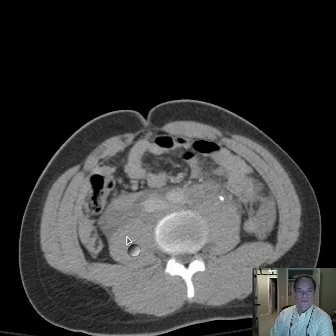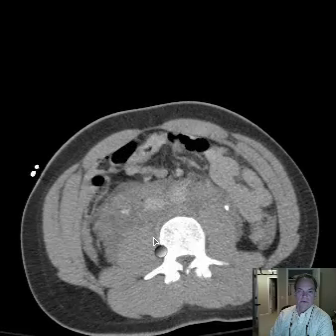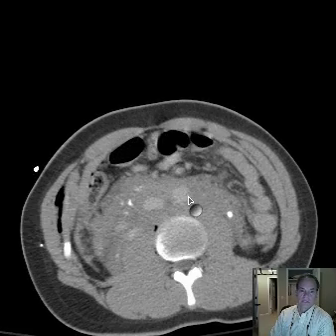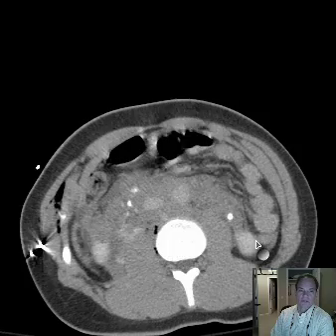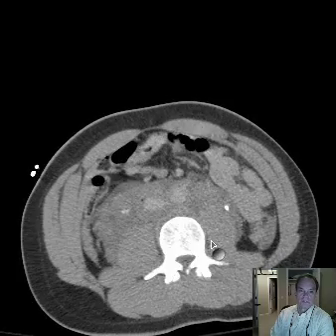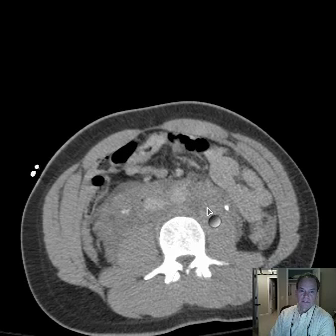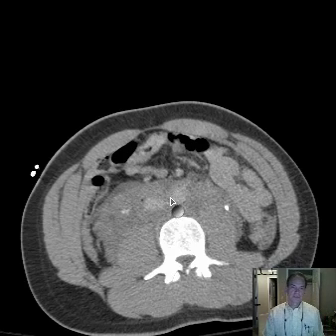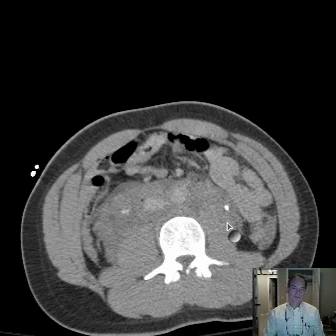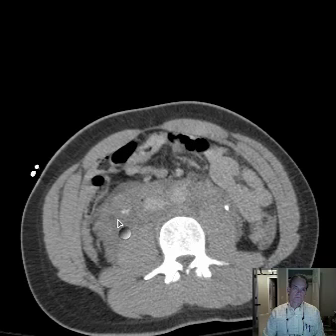What are the normal structures that we're seeing here? Where's the aorta? Where's the IVC? Well, here's the aorta and here's the IVC. They look quite small. They're displaced anteriorly. Where are they located? These are the psoas muscles.